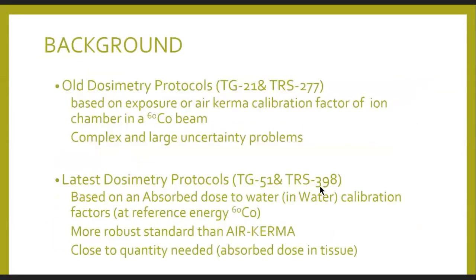So as a brief background, the old dosimetry protocols are based on exposure or air kerma calibration factors of an ion chamber in a cobalt-60 beam. The problem in these protocols is that they are based on a calibration factor not directly related to the quantity of interest that we are looking for.